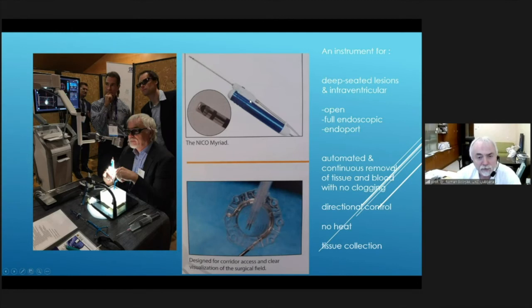One size is for endoscopy and the other for open or tubular microsurgery. The special design features a lateral inflow port which provides suction, and there is also a cutting knife running at high frequency that cuts small pieces of tissue — so there is no stopping and no clogging during removal. We can use this dedicated instrument in open surgery, full endoscopic, or tubular surgery, and our work proceeds smoothly and continuously with no clogging. Because of this lateral positioning, we have directional control of tissue removal — quite different from when the opening is at the tip.